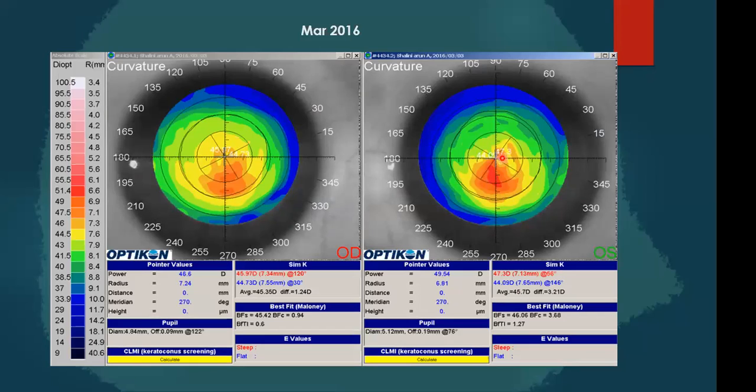So this is how important it is to follow up a patient who has got a thinner pachy also. She might progress into a keratoconus over a period of time. So it is important to maintain serial follow-ups of such patients. And the curvatural maps or the tangential maps are very sensitive to pick up such suspicious areas on the topography.